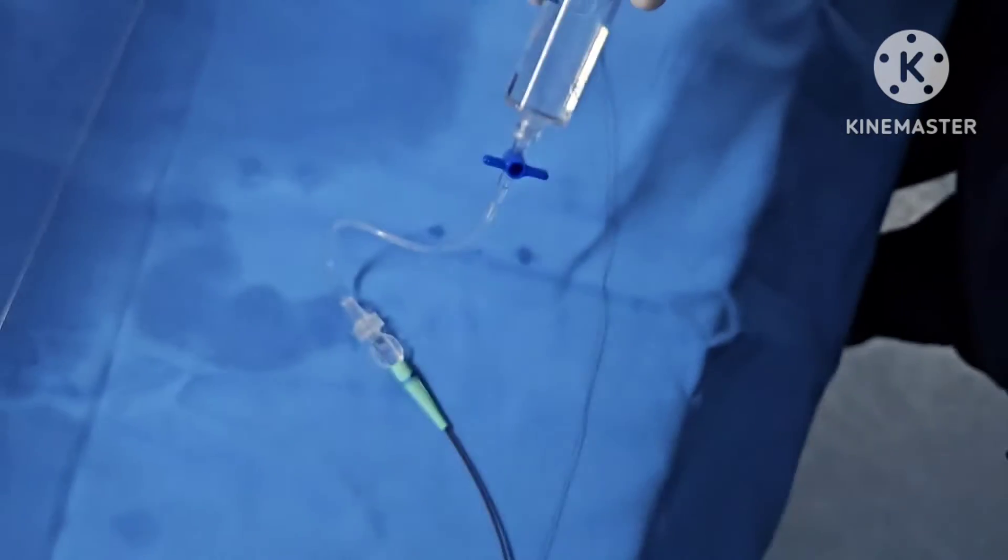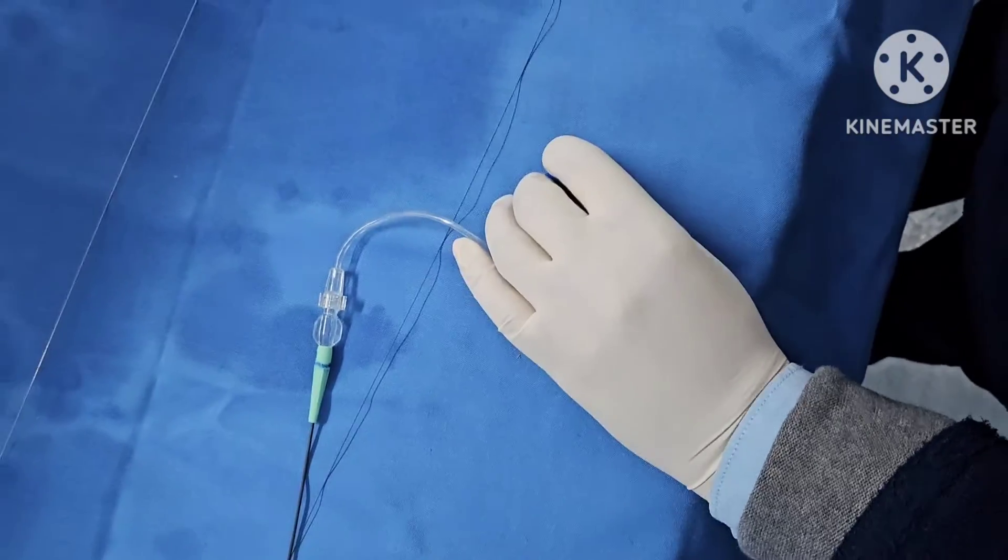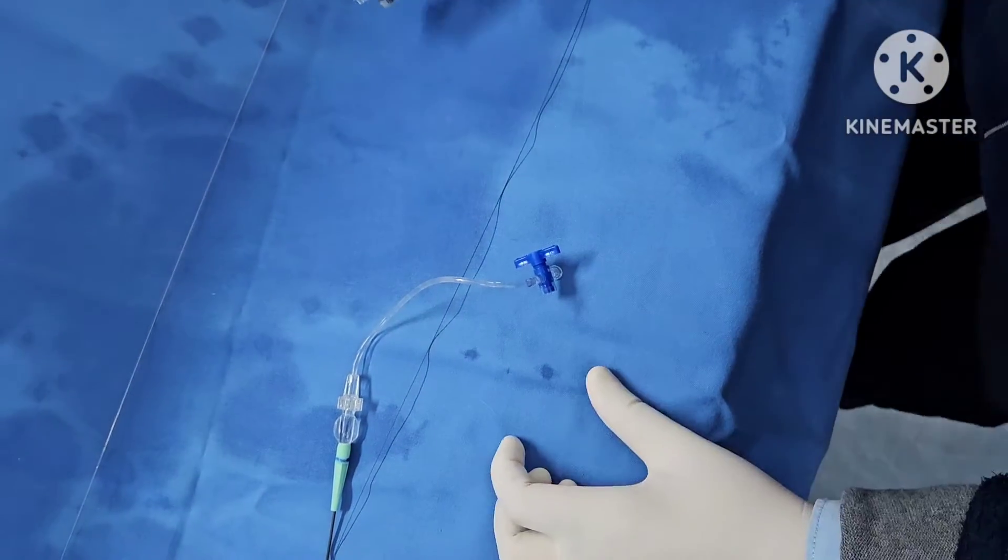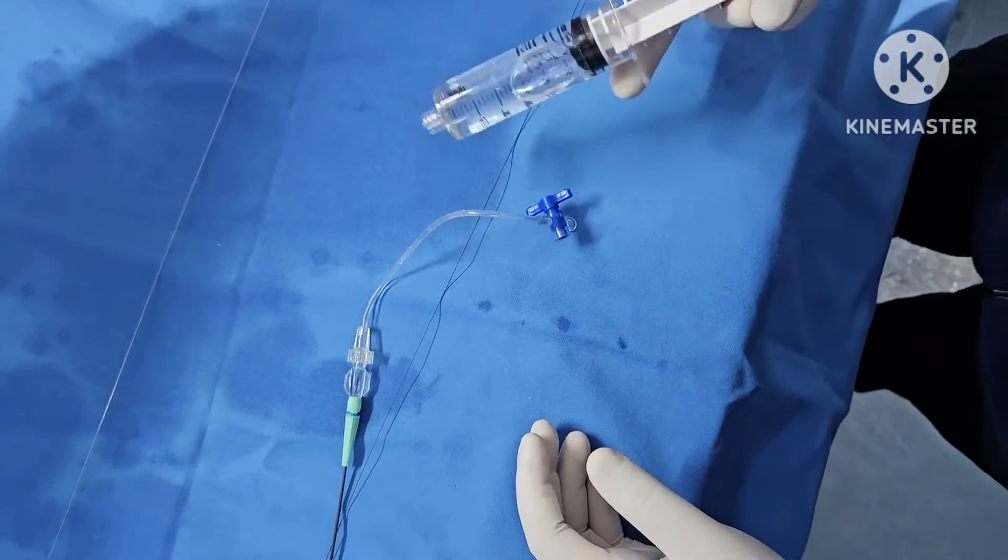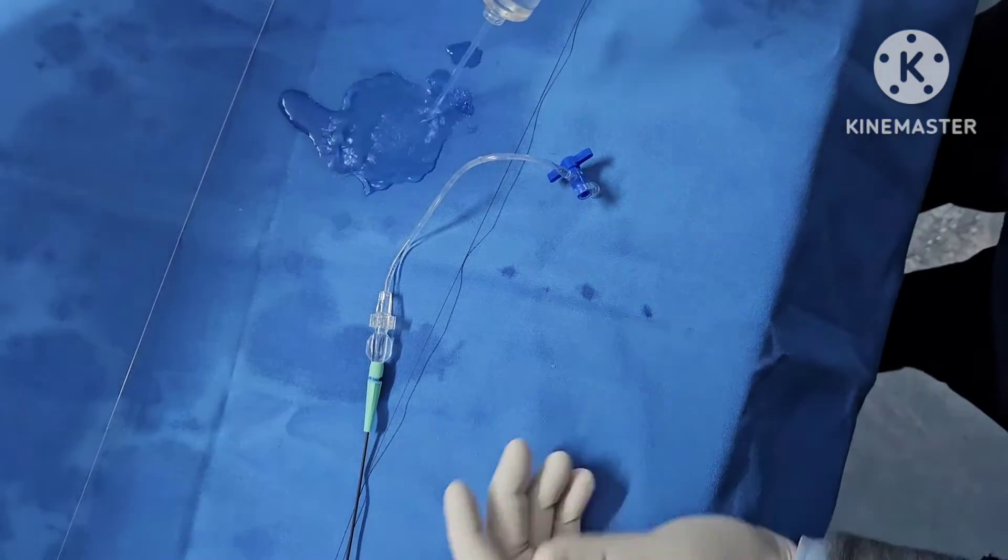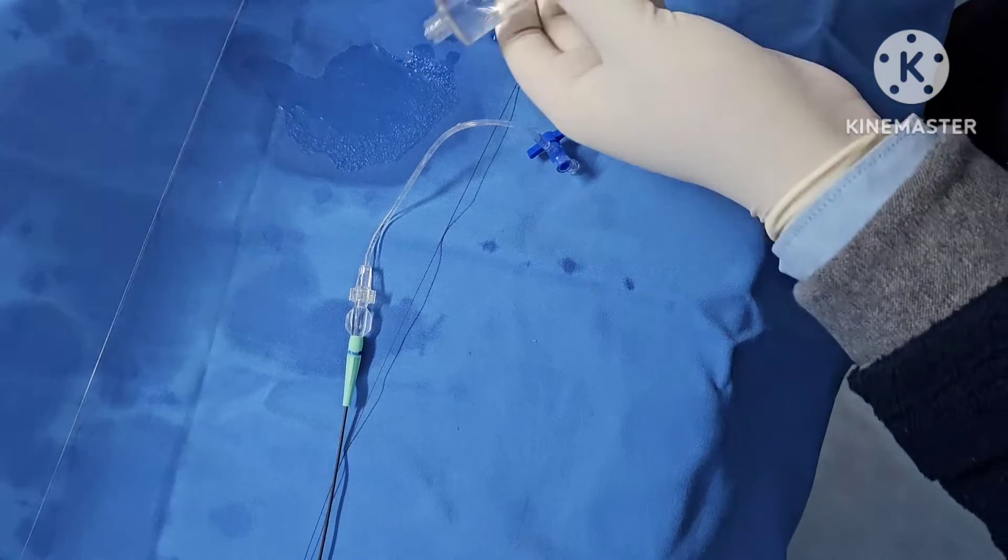So this is the aspiration. When you're finished with it, you can obviously turn it down, remove this, and you're done with the aspiration. If you have been supplied a mesh with it, then you just insert the aspiration catheter and you're good to go.